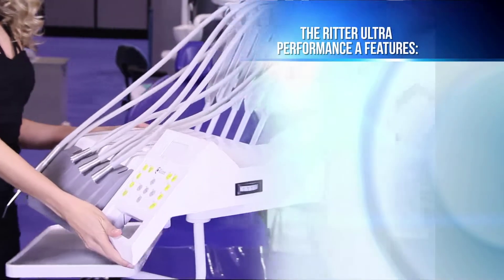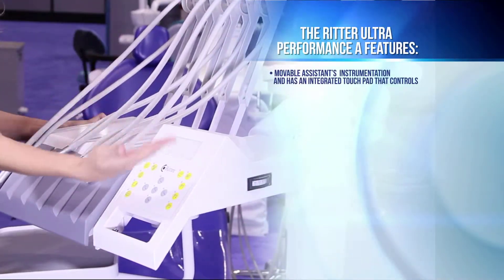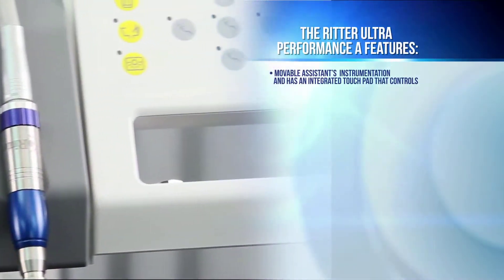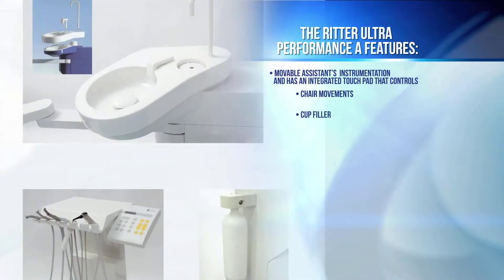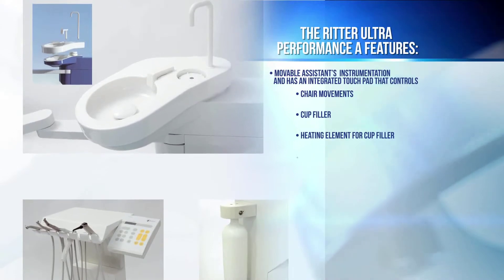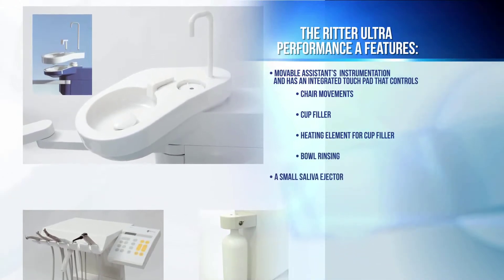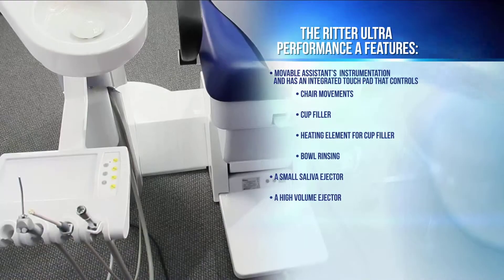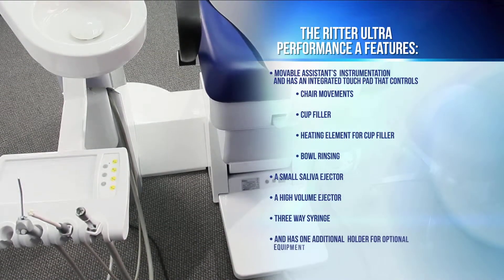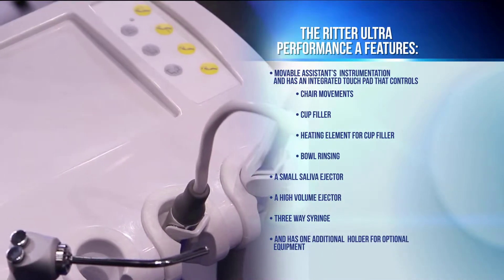The Ritter Ultra Performance A features movable assistance instrumentation and has an integrated touchpad that controls chair movements, cup filler, heating element for cup filler, and bowl rinsing. It comes standard with a small saliva ejector, a high-volume ejector, a three-way syringe, and one additional holder for optional equipment.